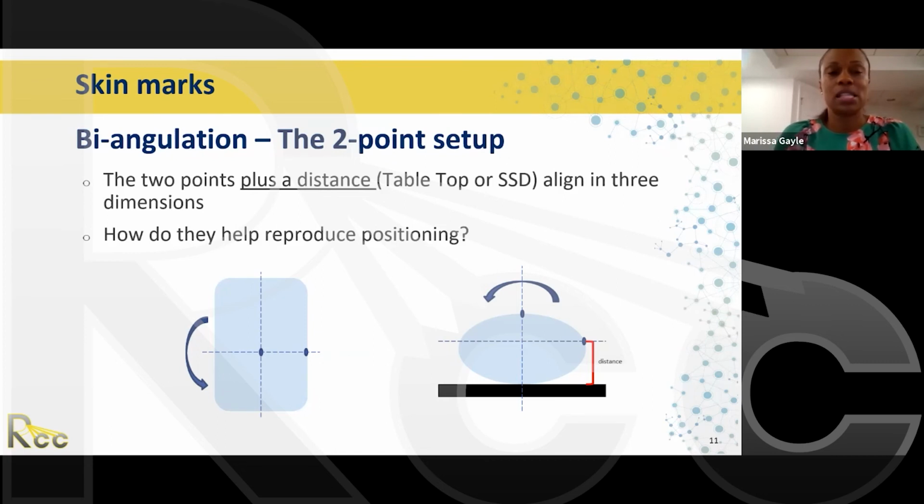Sometimes the bolus is planned at the time of the CT scan, and we have one there. Sometimes the bolus is generated after, and then myself as a therapist will have to either cut the Superflab to make sure it's the right size, or it may be wet gauze, depending on where we're treating. So my clinic could go either way.